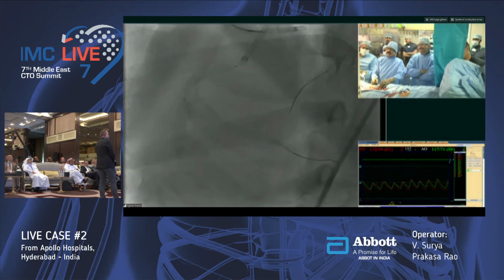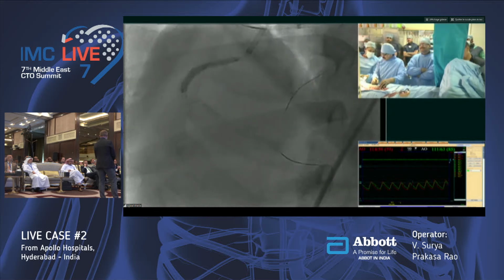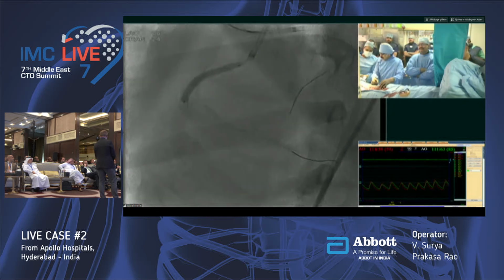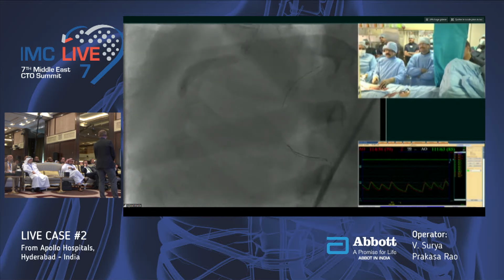Yeah, the strategy. Now it is retrogradely filling, so there is no acute issue for him. One question here is how much contrast and radiation have you used so far? Because I agree with you, you should get it, but if you used 7 gray, maybe it's not the best time to start on this.